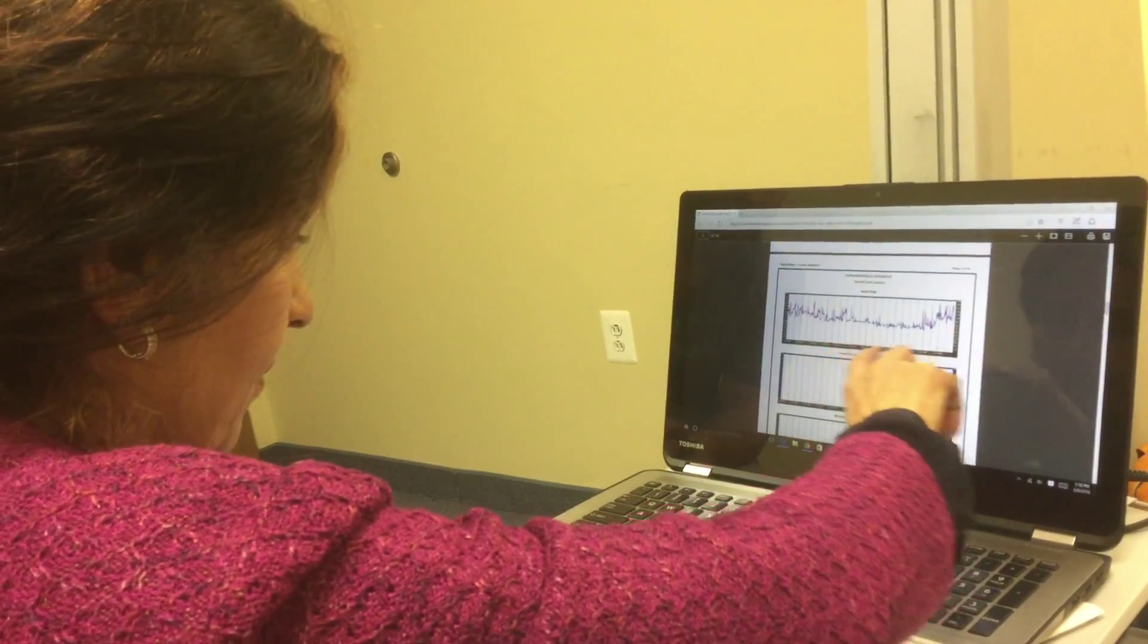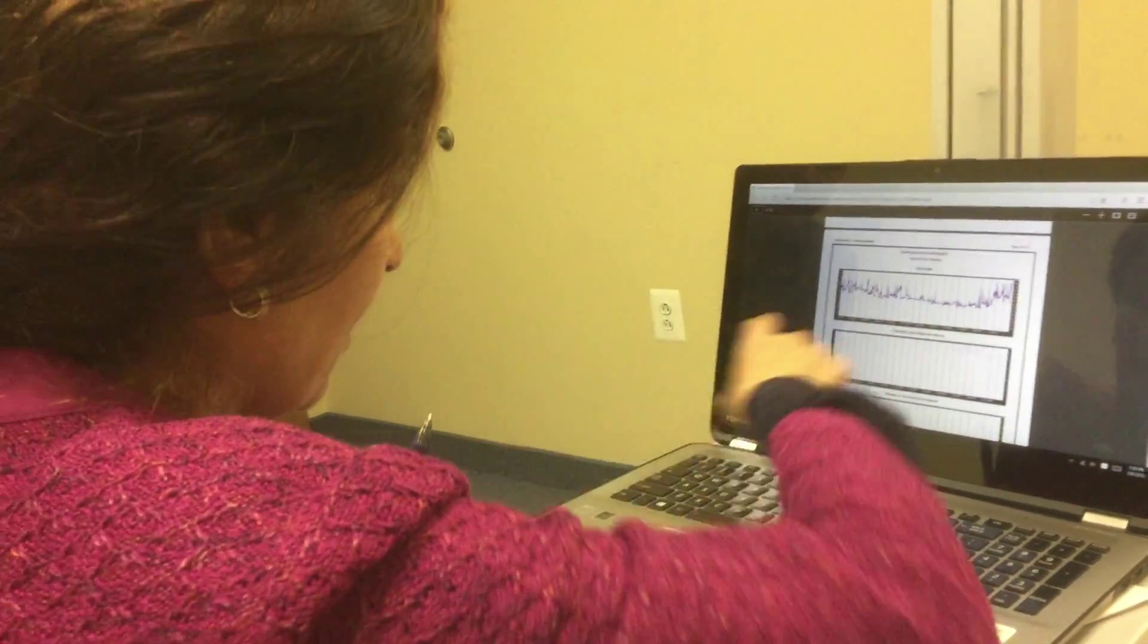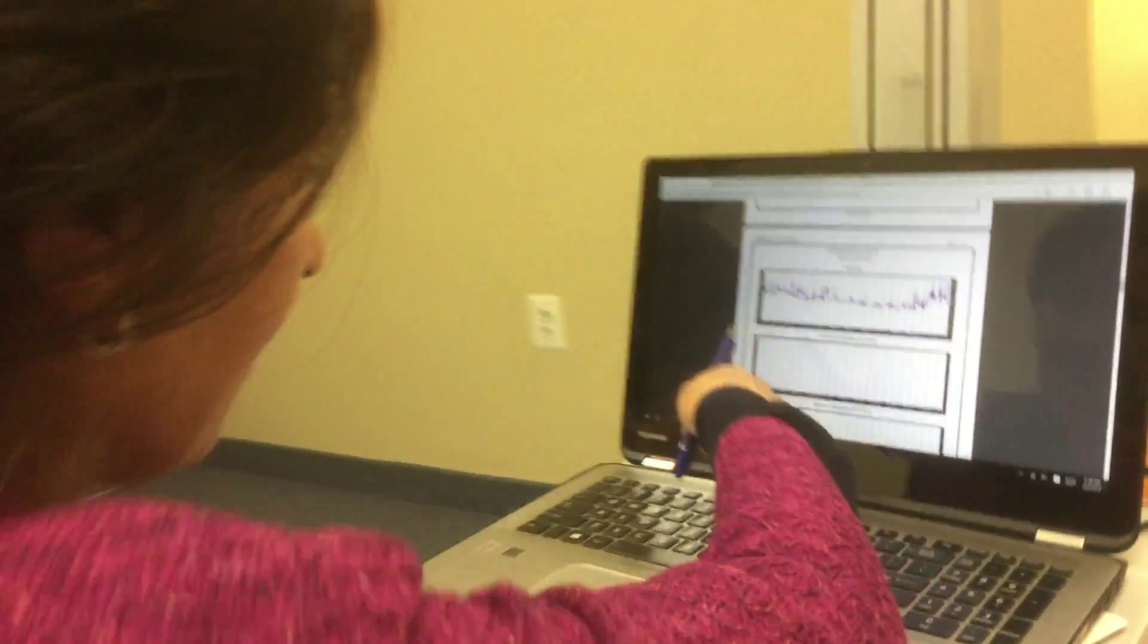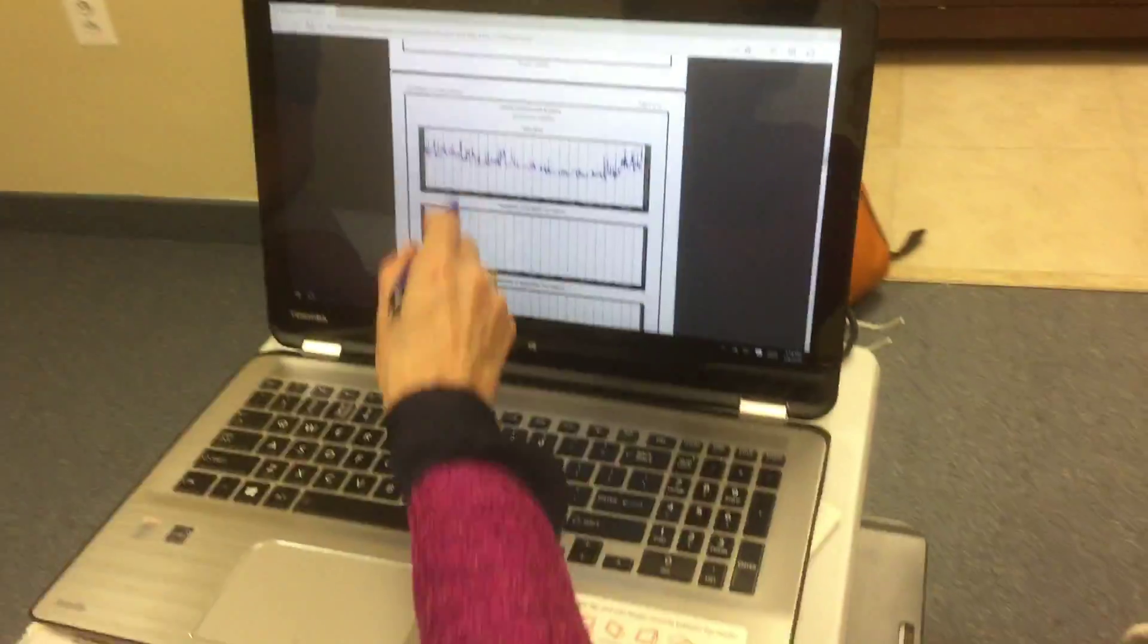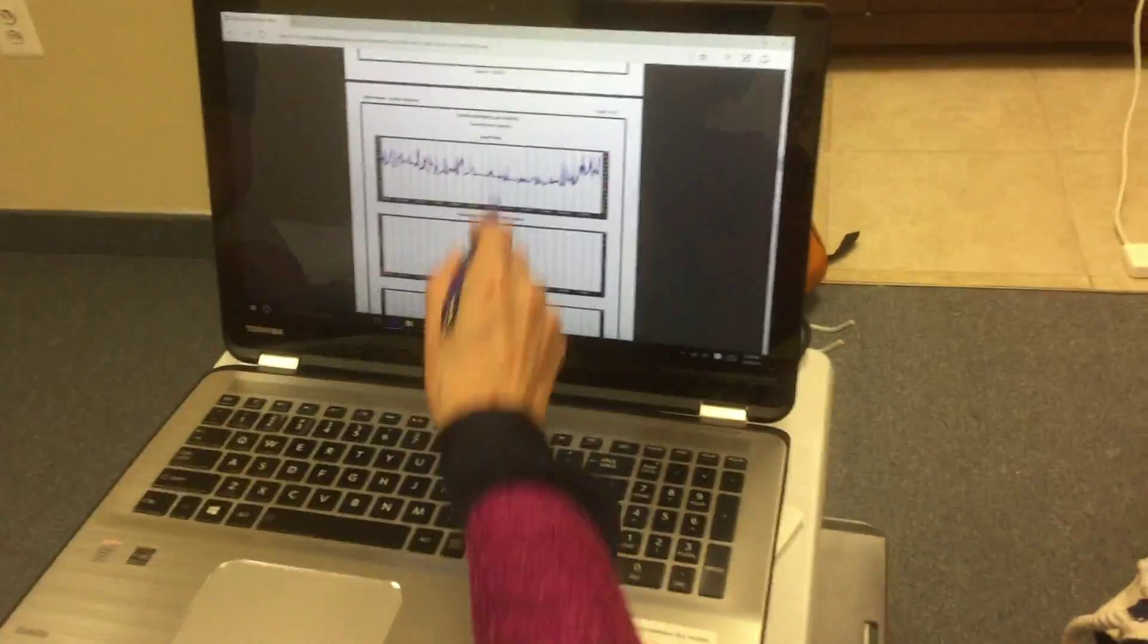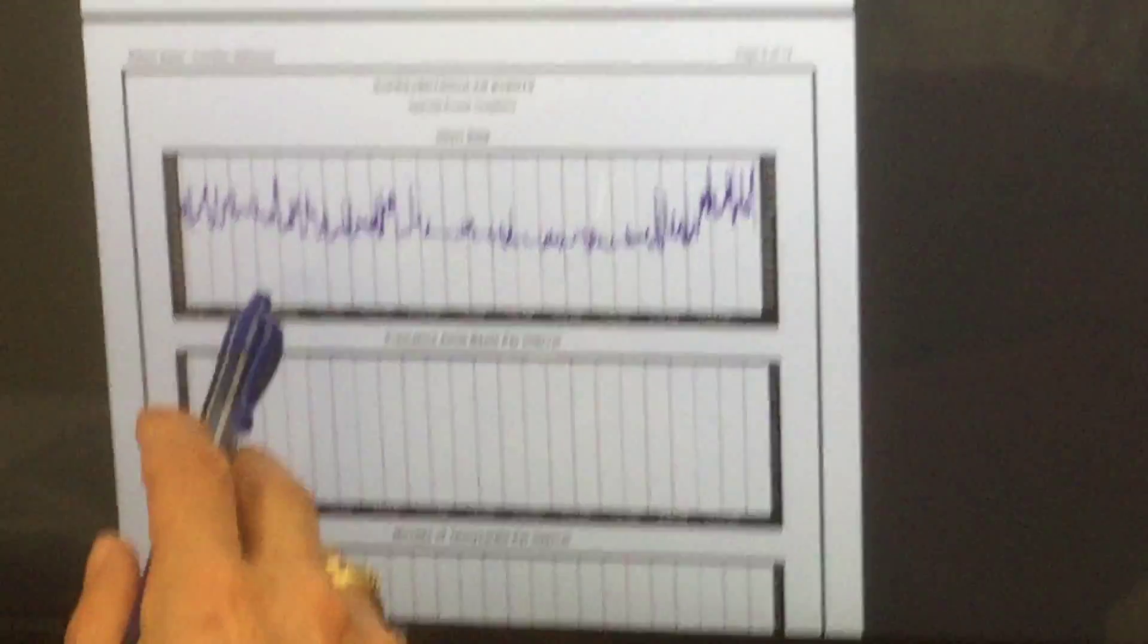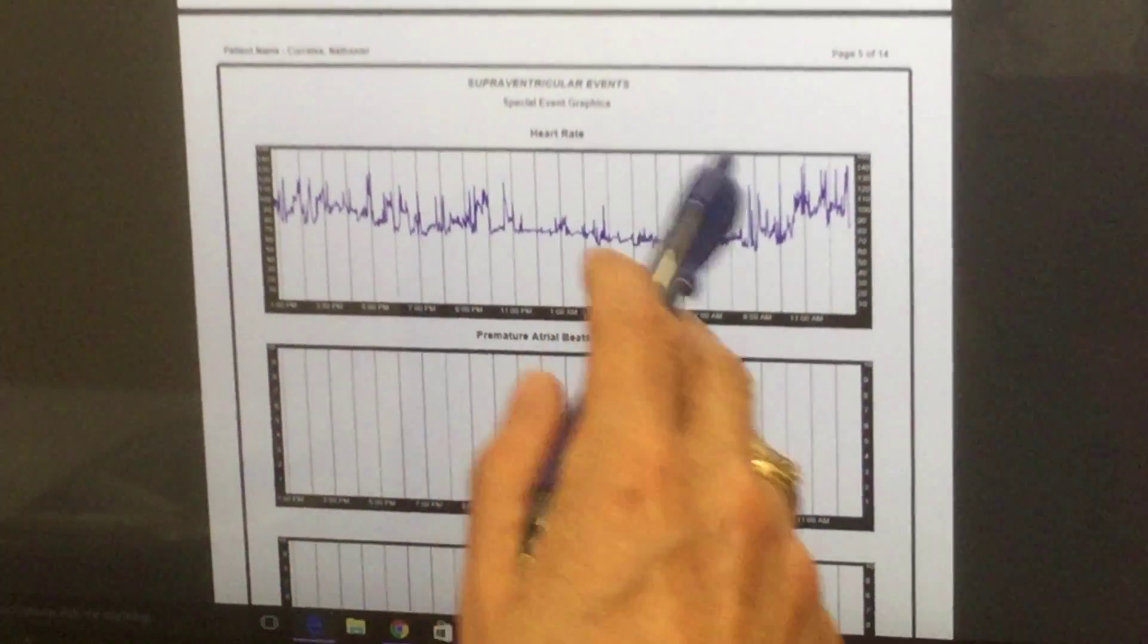Now this one is the Holter monitor, but look at these spikes. This is what we call spikes of tachycardia. Your heart rate spikes during the day a lot, and you go up to 120 to 130, 130, 140, 180.